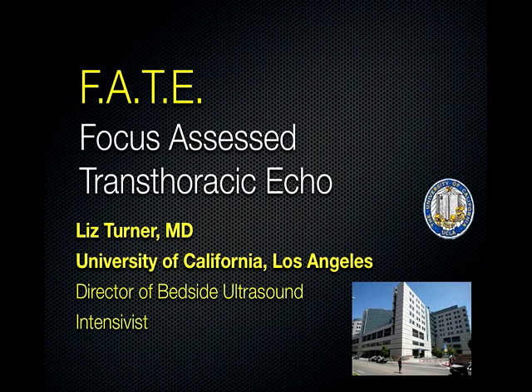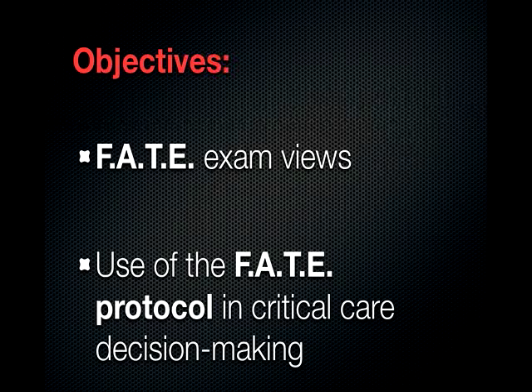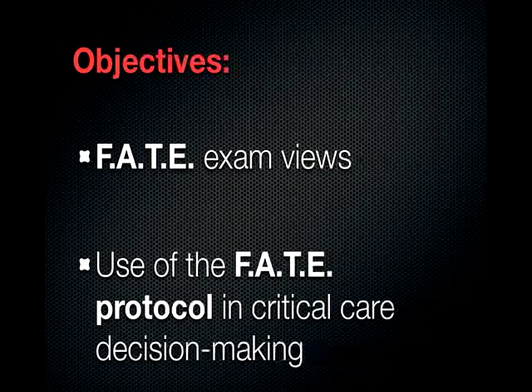This talk will focus on the Focused Assessed Transthoracic Echo. This is a point-of-care application that primarily looks at cardiac function. Today we're going to talk about the F.A.T.E exam views. These are the three major cardiac views. And we'll also talk about how we incorporate the F.A.T.E protocol into our decision making in both critical care and hospitalized patients.